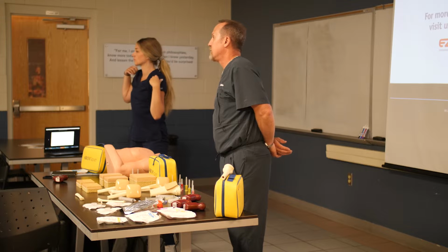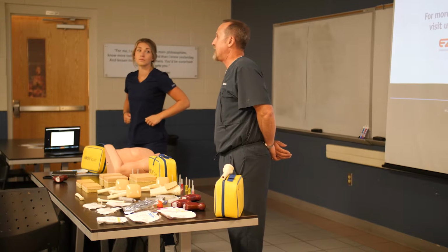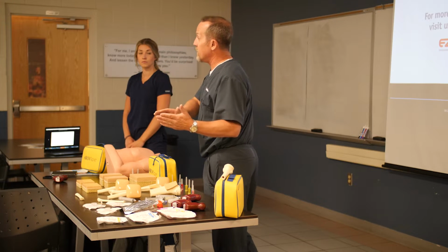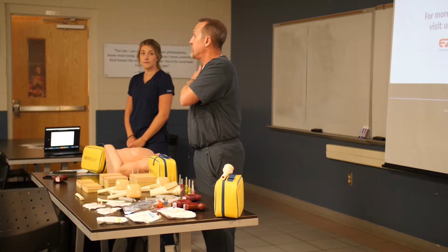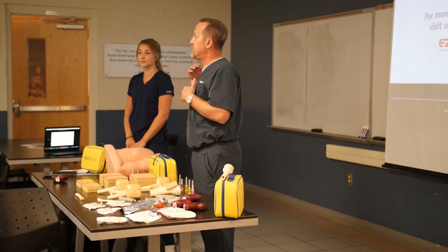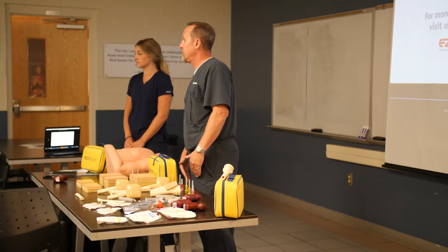The age range for the humeral head? Humeral head is anybody and everybody. Typically, if your patient's 9 years and younger, it's gonna be difficult to landmark that area because their bone formation isn't completely there. So typically 9 years and younger, I would try to defer to the femur.